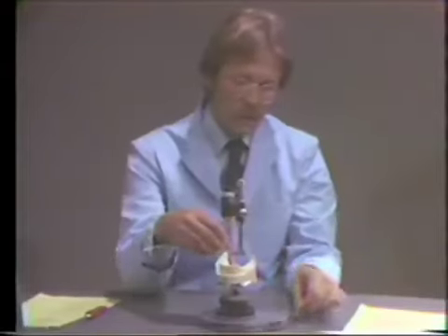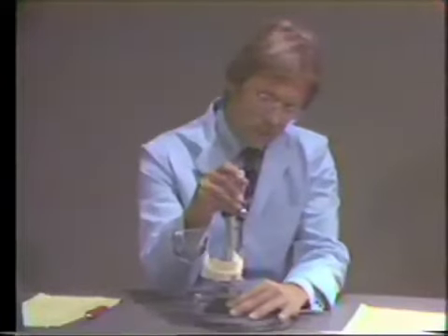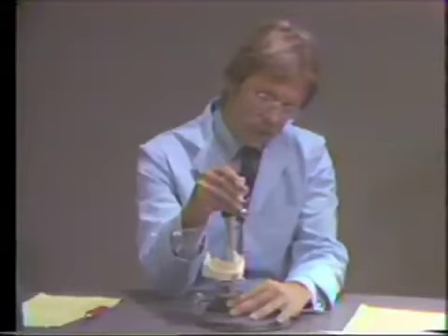So I am going to replace the analyzing rod with the undercut gauge and check to see if I have adequate undercut on the potential retentive surface of the bicuspid crown, because here I know that it's caries free, and I would like to determine if there is an adequate amount of undercut without having to go to either a class 5 restoration or a full crown restoration.